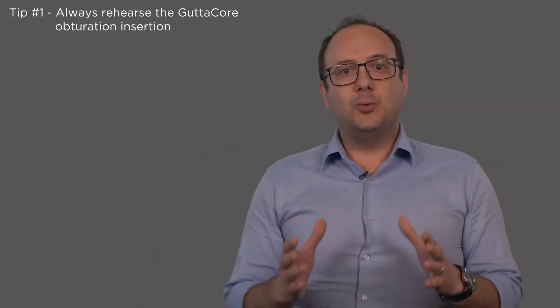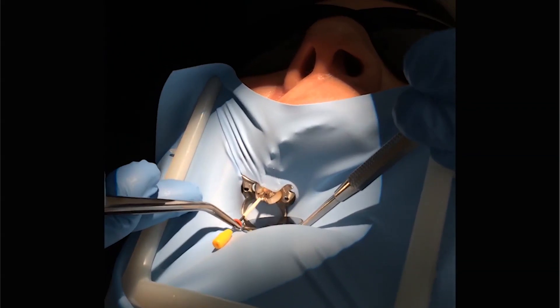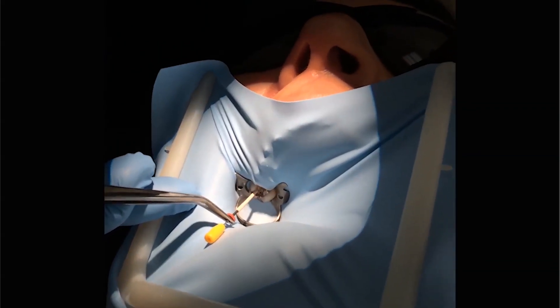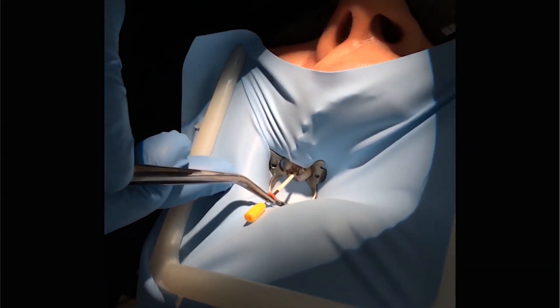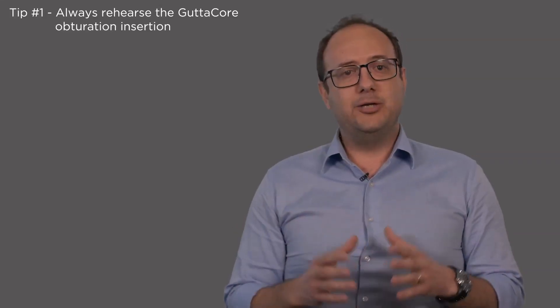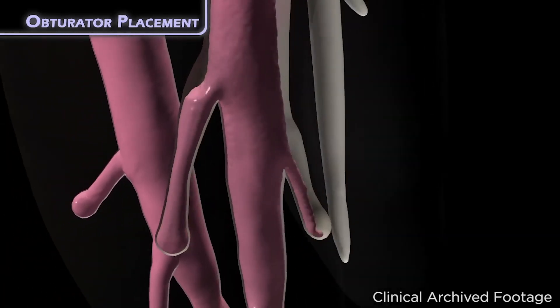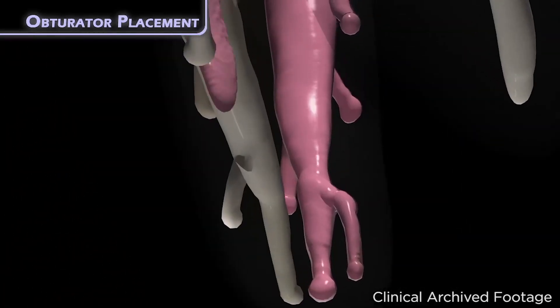The first tip is to always rehearse the GuttaCore obturator insertion. You can do it with the obturator verifier, simulating the path you'll have to complete between the GuttaCore oven and the patient's root canal. By doing this, more than once if needed, you'll guarantee a much more predictable and correct application of the GuttaCore obturator.